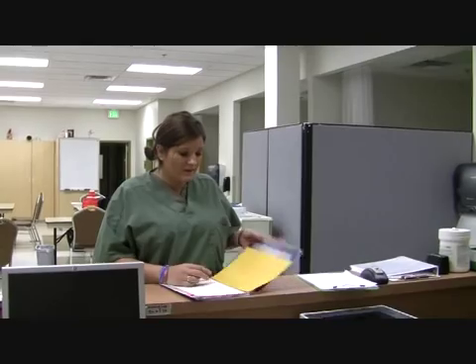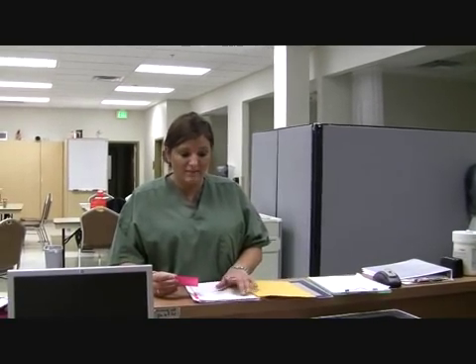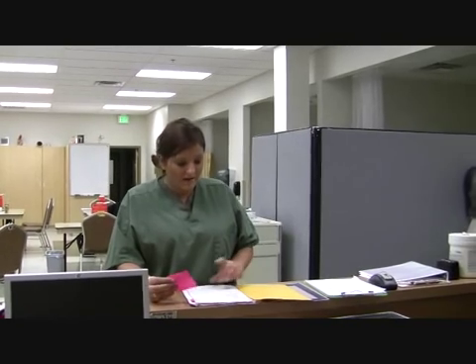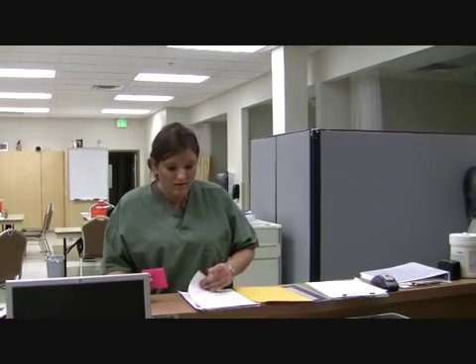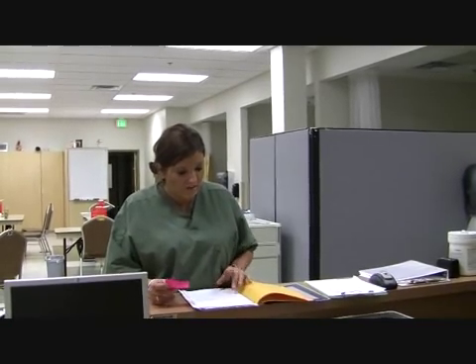So I'm going to make sure I have the patient's card. This is an accurate patient identification. Should be everything that's the same that's on the patient's bracelet. I'm going to make sure all this information matches. Same name, same spelling, same medical record number, same birth date, same doctor. And it does. So with that, I am going to look and see what my cross match is and make sure everything matches my card once again, which it all matches.